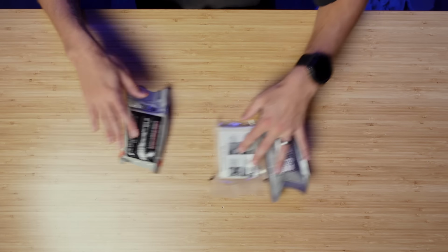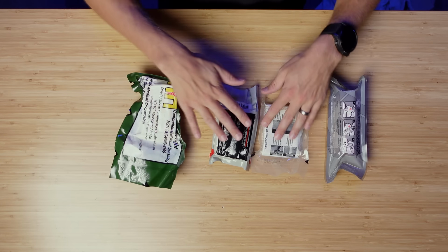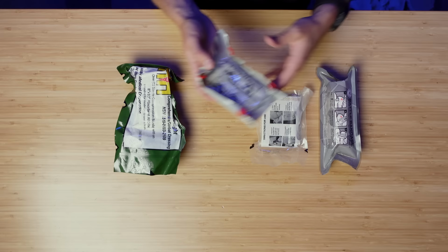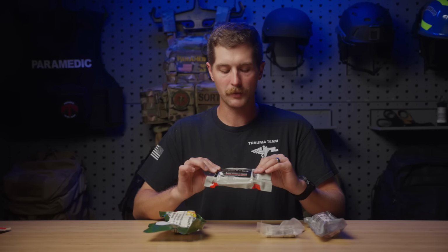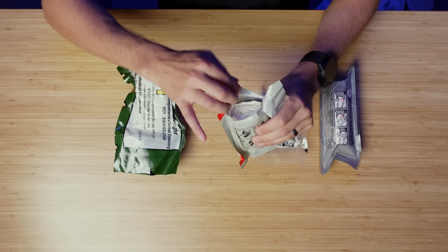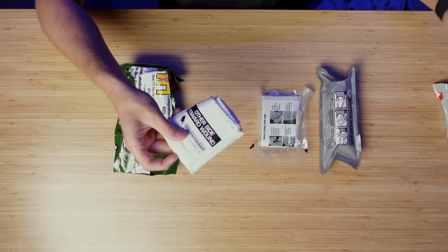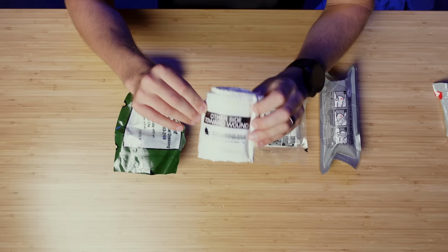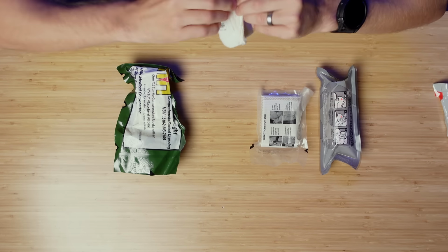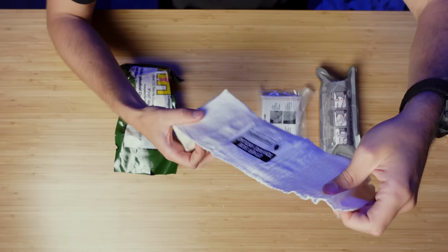Let's move on to our pressure dressings and a couple different options from a couple different vendors. So most commonly, let's start with an emergency trauma dressing. This is the North American Rescue 4-inch ETD. The red, you can open it at the red. And then we reach in, grab it. This says other side towards the wound. So as we open it, it's Velcroed to itself and then it'll start to open.